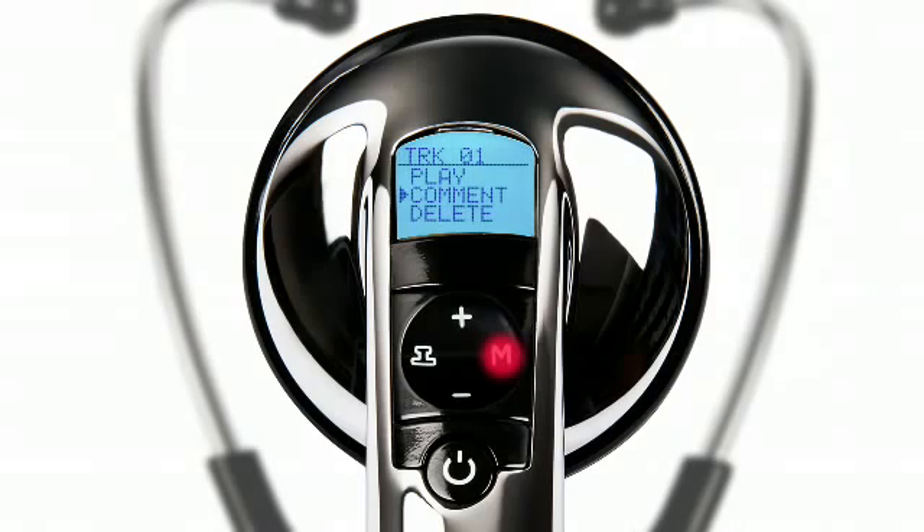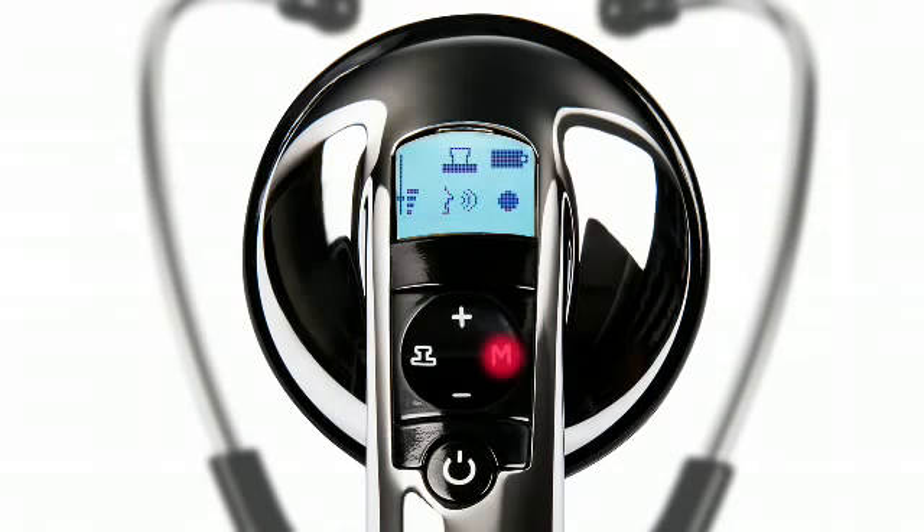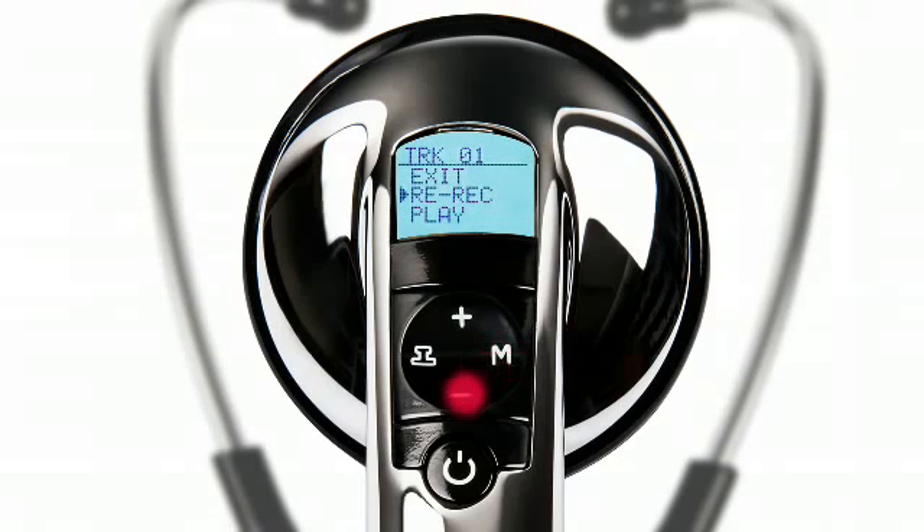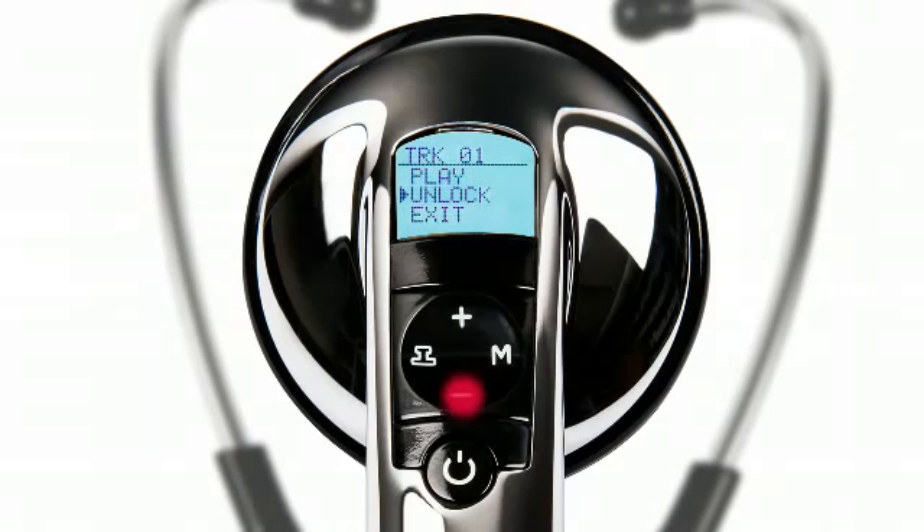The 12-track version lets you add verbal annotations to remind you of the contents. The menu gives you the option to rerecord, delete, playback, lock, and unlock the recorded track.